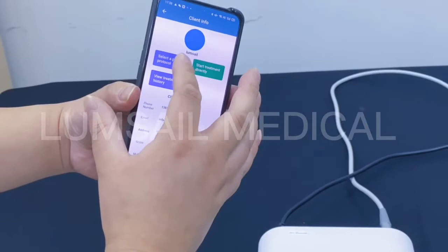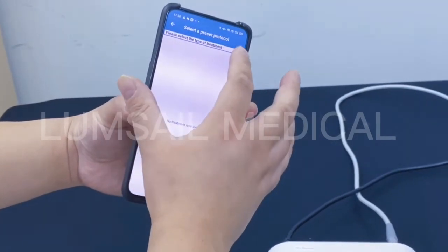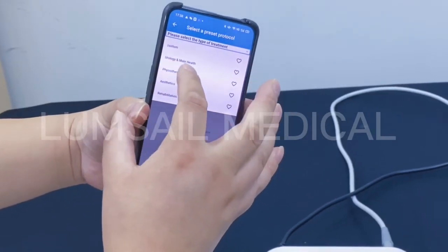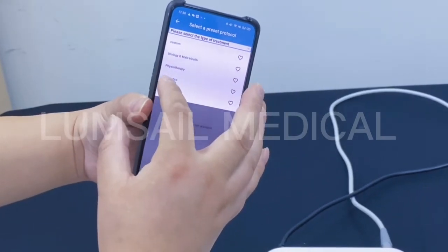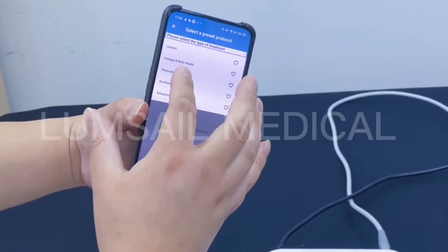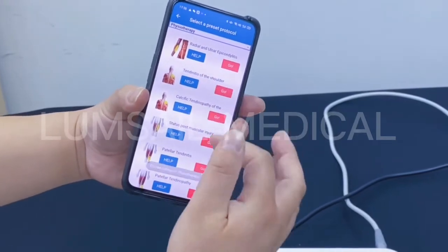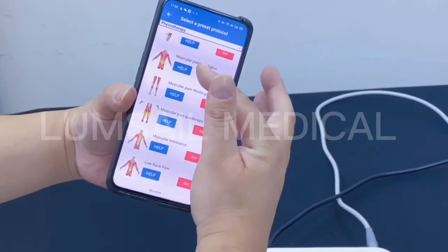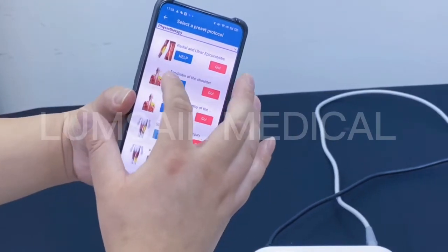Since it is a new user, we use the 'select preset protocol' option. You can choose different protocol types, for example urology and male health, physiotherapy, aesthetics, or rehabilitation. We select physiotherapy as an example — it has multiple preset protocols, with up to 20 protocols to choose from.